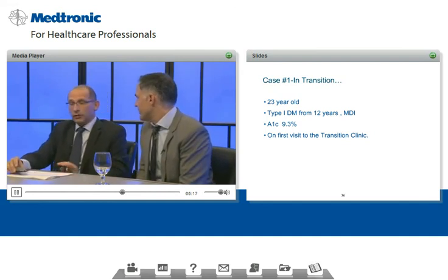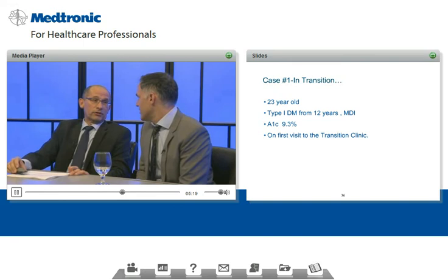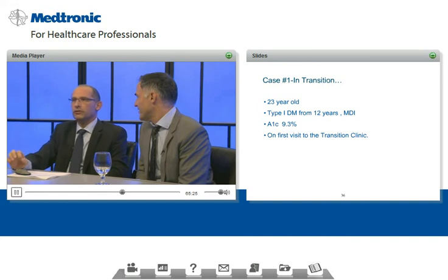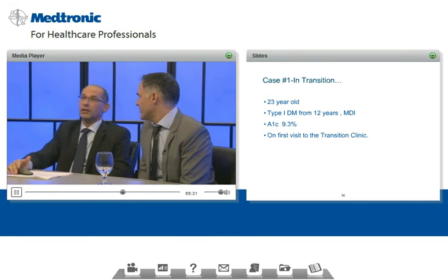Well, I do agree. The machines will not take over our job yet. We still have to look at each case and change, and really, the point is to do one step at a time, because it's very difficult to fan out between the basal problems and the bolus problems. And even though it seems to be simple, it's simpler using the downloads, but it's not trivial.